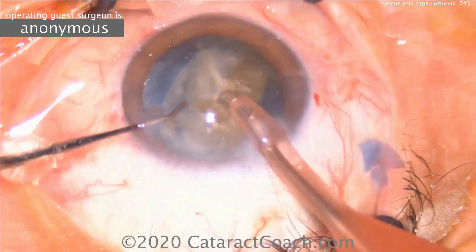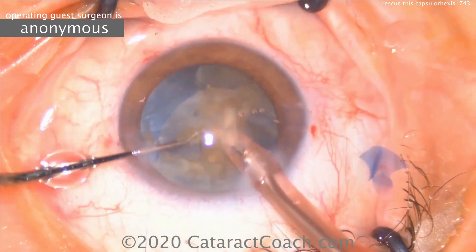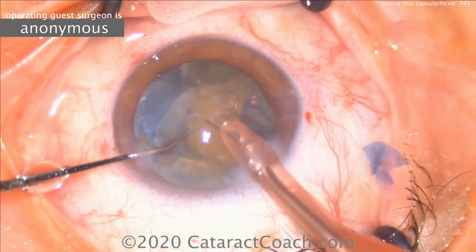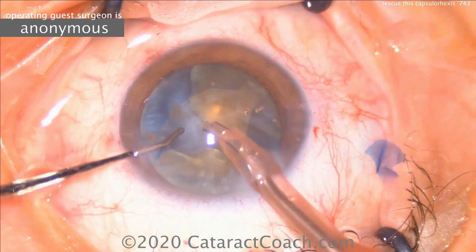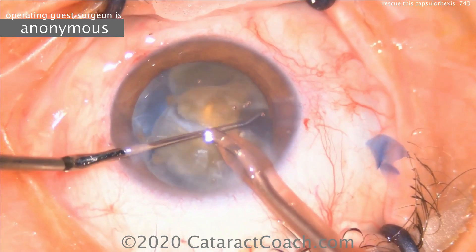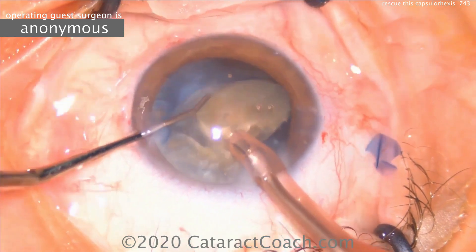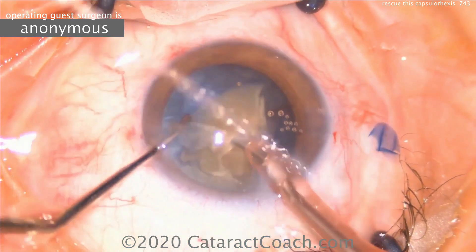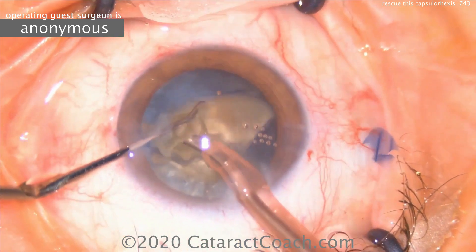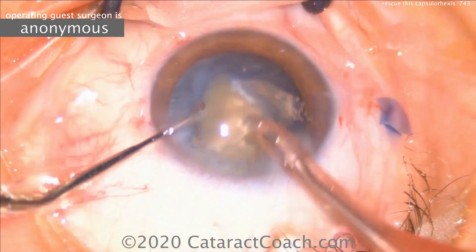This technique works very well because the nuclear pieces are now brought up out of the capsular bag. The big danger here is if you try to do a divide-and-conquer technique with two areas of the capsule that are very weakened — when you try to split the nucleus, you may actually rip the posterior capsule wide open. Care has to be taken to be very cautious here.